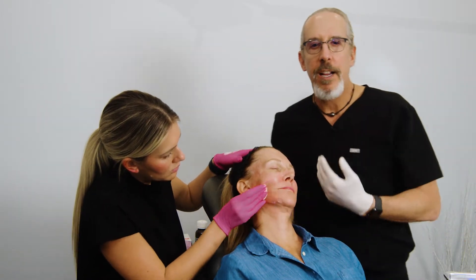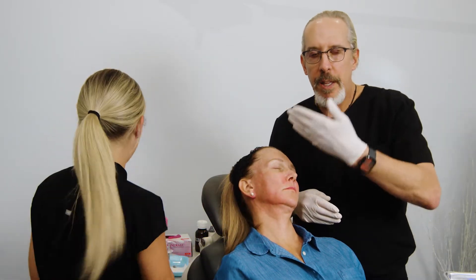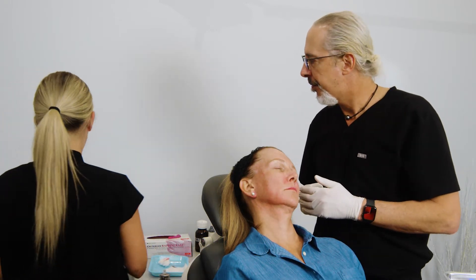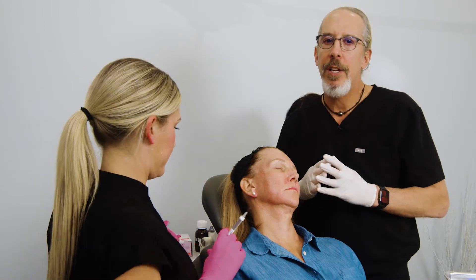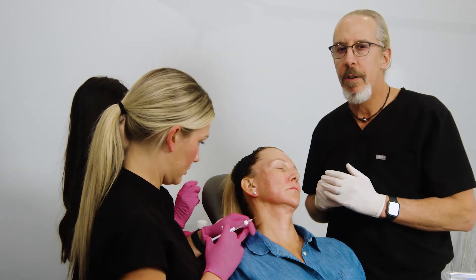As we get older we lose that gonial angle, we lose that definition - we lose the definition between the jaw and the neck. This gives us a little shadow between the jaw and the neck. We're going to be injecting two boluses of 0.25cc, so half a cc per side. You don't want to inject too much on a patient in their 50s or 60s because it does widen them a little bit, but you do want to improve the definition.